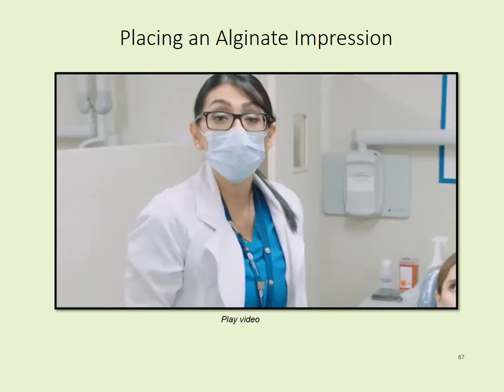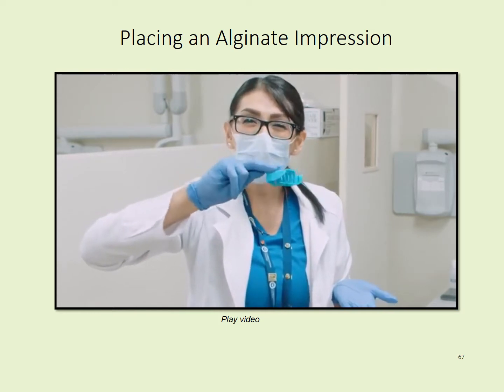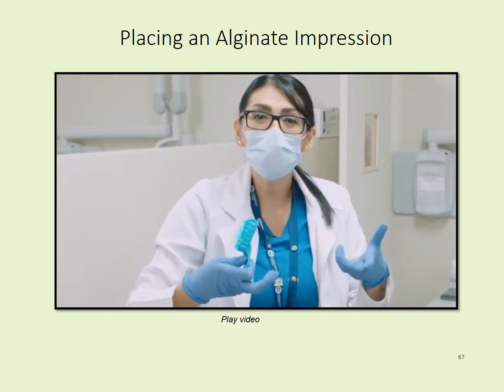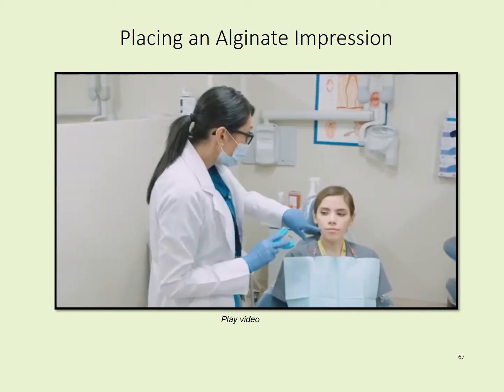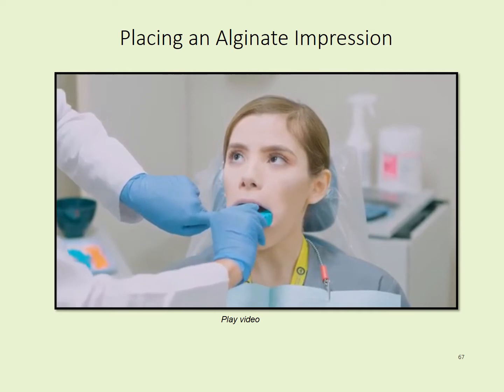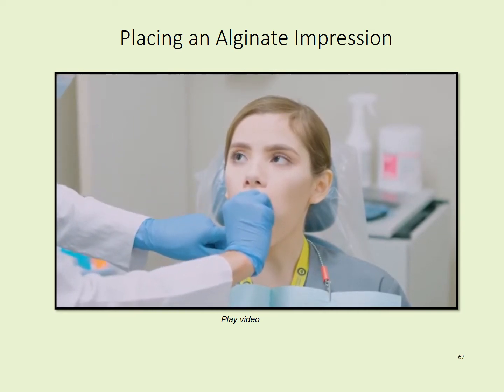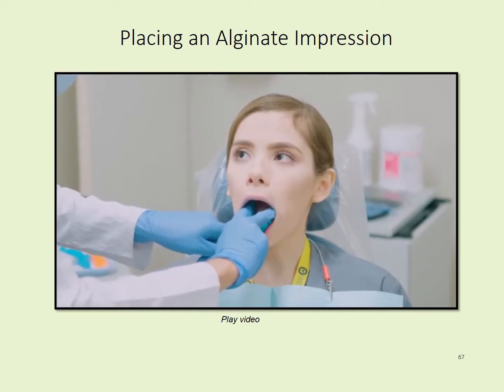The goal of trying in the tray is you want to make sure that the tray seats all the way down and you have a little bit of wiggle room so it's not tight against the teeth where you can miss that on the impression. And so again, open please. We retract, slide in, bring our tray, retract the lip, line up the midlines, and press the tray down.